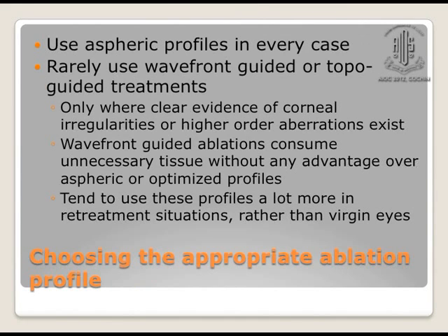You should also choose the appropriate ablation profile. You should use the aspheric profile in every case because that would retain the prolateness of the cornea, thus reducing the induced aberration, and therefore the patients would not have night vision difficulties. There are very few incidences in a virgin eye where you would actually need to use a true customized wavefront ablation or a topo-guided treatment.